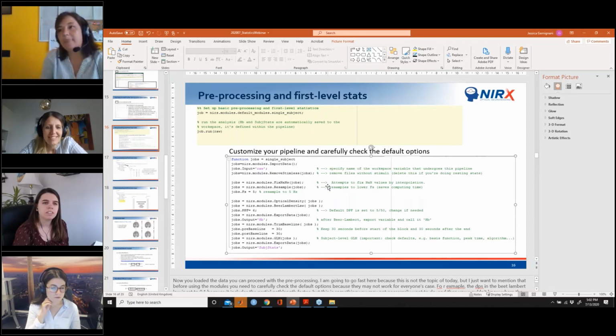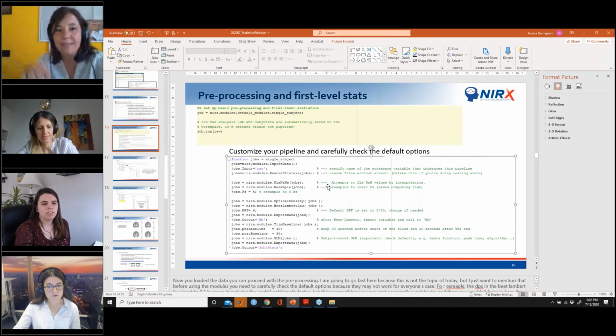Okay, so if we're talking about ANOVA, I'm not sure what the user means by ANOVA, because if we're talking about the ANOVA the way I've shown, this is the ANOVA on the output of the mixed effect.